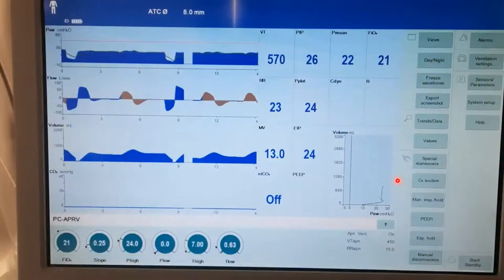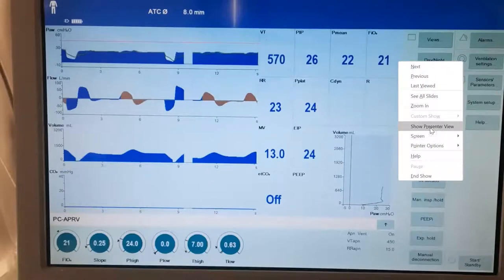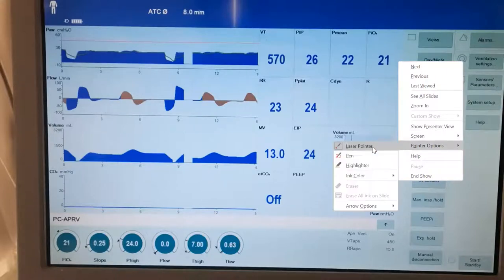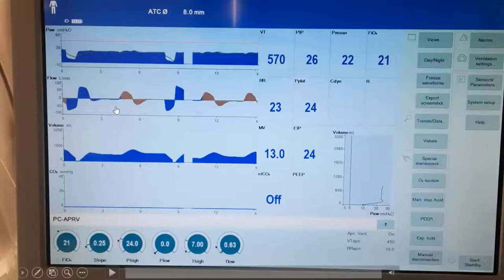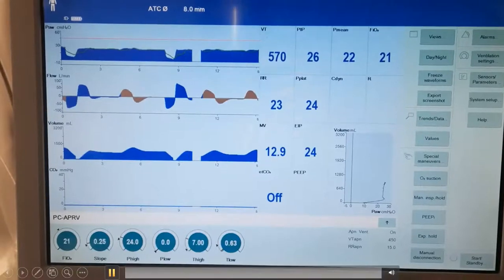For those who are more visual learners, here is a patient on APRV in real time — you'll see spontaneous breaths on the CPAP level and brief releases with air trapping. Note that this patient's T-high level probably needed adjustment, as some tidal volumes reached about 12 mL per kilogram — we'll discuss that after the video.